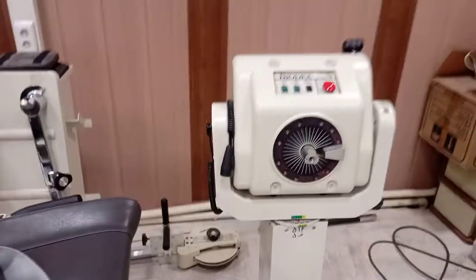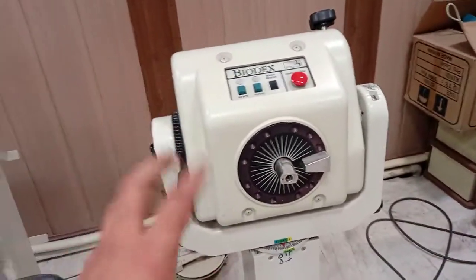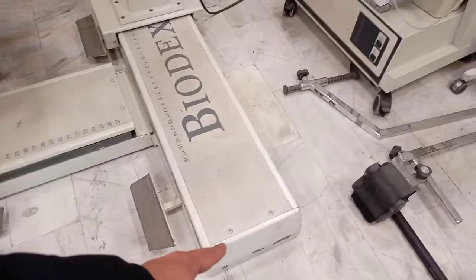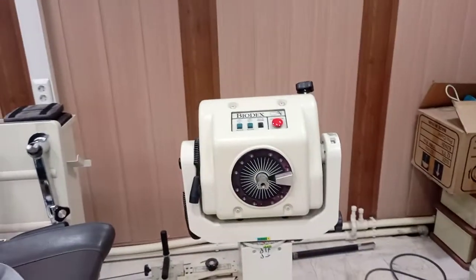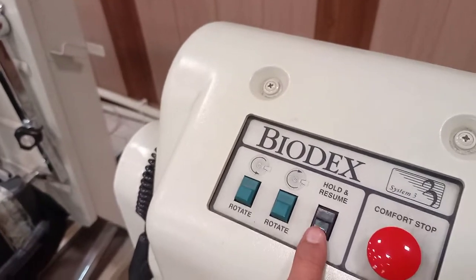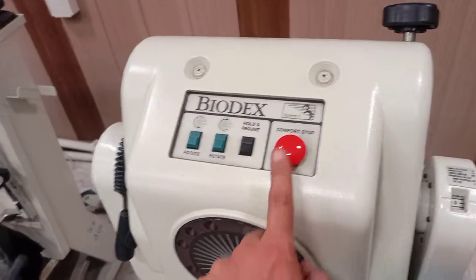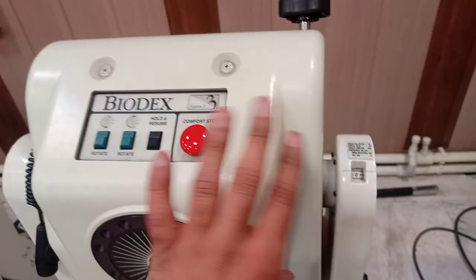Let's talk about the platform itself. This is the main dynamometer, which is responsible for measuring torque, angles, force, and everything it outputs. This platform can move in either direction — it can go over there as well as come over here, and you can change the direction. There are buttons to increase or decrease the range of motion, rotate clockwise or counterclockwise, and hold or resume. When you press this, the rotor is free to move easily. This is the emergency or comfort stop — if anything goes wrong during isokinetic testing, you just press this. This angle display shows that the Biodex system is currently at 0 degrees.